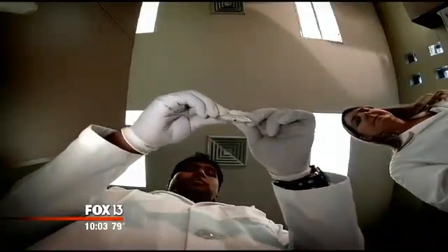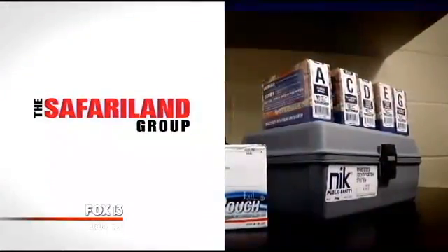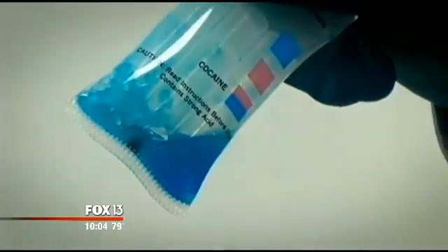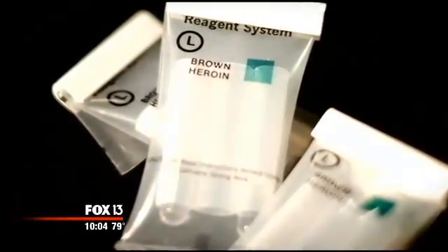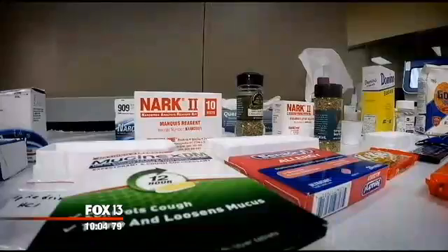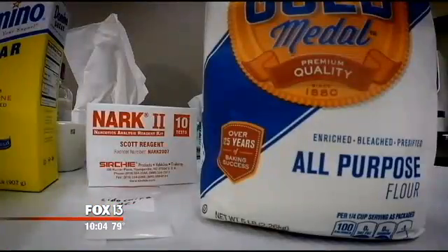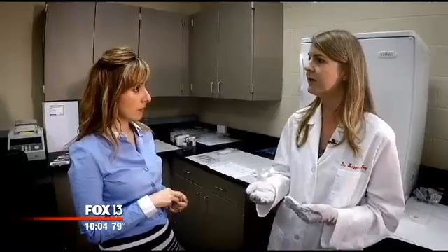invited us to observe a series of controlled tests on field drug test kits purchased from two websites, Safariland Group and Sirchie, which sell products to law enforcement agencies. But it doesn't matter who the manufacturer is. All three believe all field drug test kits are unreliable. The chemistry, the chemicals in the tests are the same regardless of who makes them. They show us run-of-the-mill coffee, basic items, aspirin. We'd find a Hershey's chocolate bar in any supermarket. Oregano, a spice. What we're gonna do today is look at these common materials and test them in the kits and look at the color reaction.